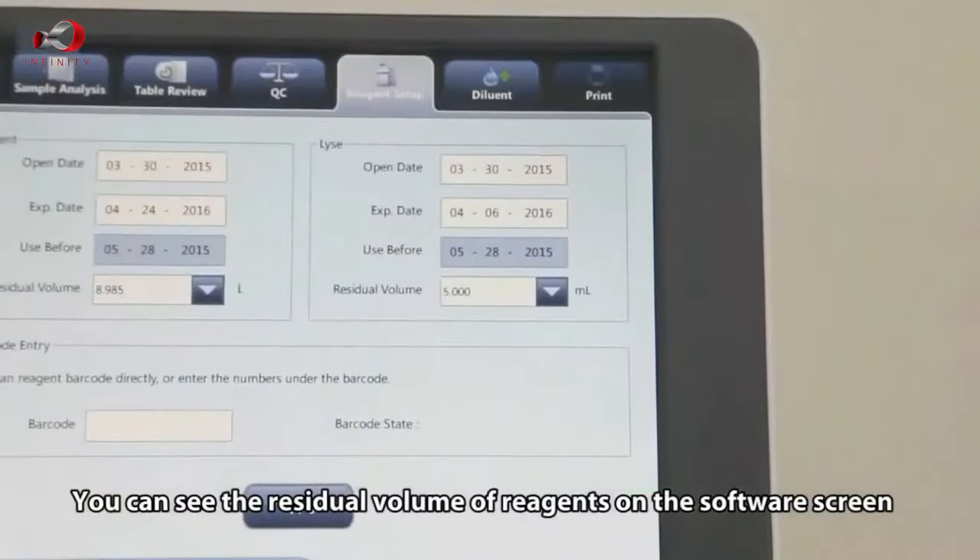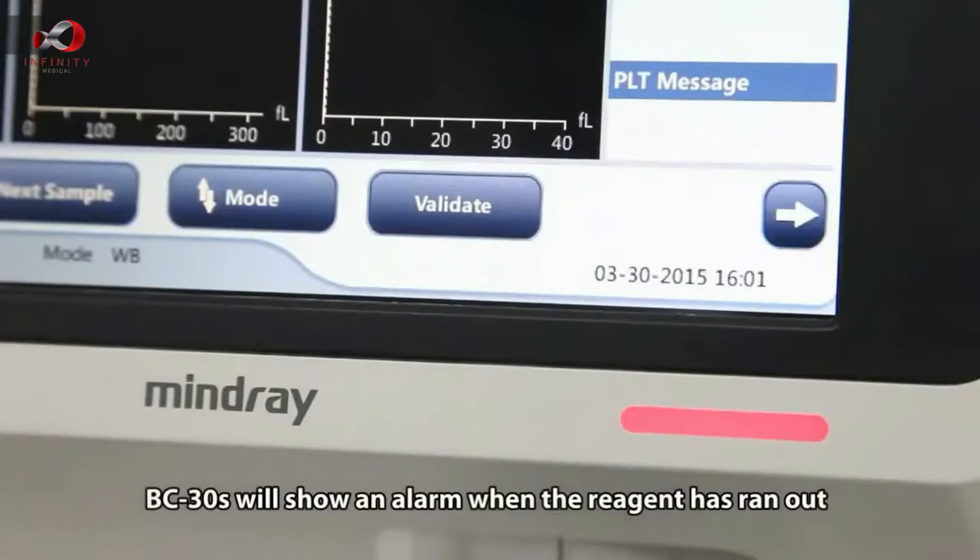You can see the residual volume of reagents on the software screen. The BC-30s will show an alarm when the reagent has run out.